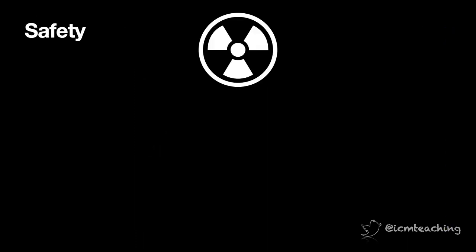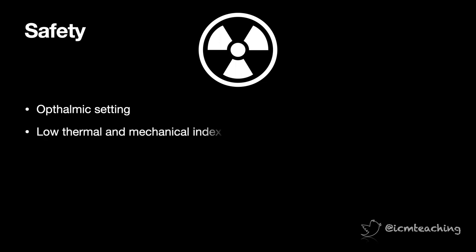And finally, a couple of important safety tips before I go. Please note I've used the ophthalmic setting on this GE Venue machine, and this ensures a low thermal and mechanical index which will not cause damage to the eye. And finally, keep scanning time to a minimum.